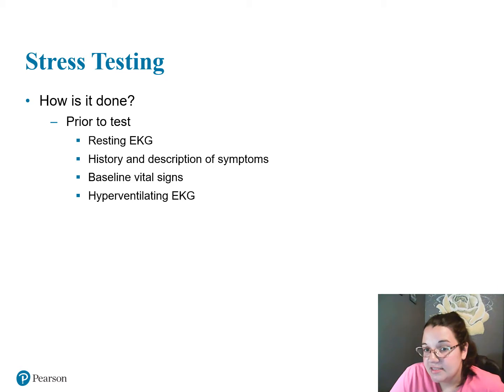Prior to the test, we're going to do a resting EKG. So we're going to have our patient relax and be still, and we're going to get their heart rate and heart rhythm. Then we're going to look at their history and description of symptoms. This is important to know because this is your test question.